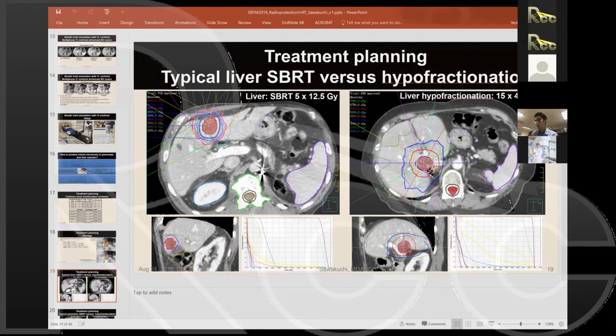The one thing I would like to mention here is that with breath hold imaging, sometimes people think it's enough to do just 3 breath hold scans. But what we have found in some instances is that that may not be enough, and we probably need a bigger sample size. There's also some systematic difference between how patients hold their breath at simulation and what happens at the time of treatment. So there is some potential for mistreatments or a geographic miss, and it has happened in some instances. So be careful about not limiting the number of breath hold scans.